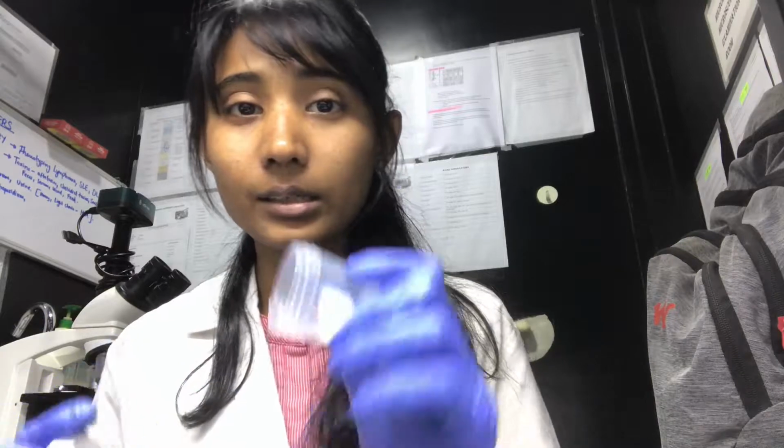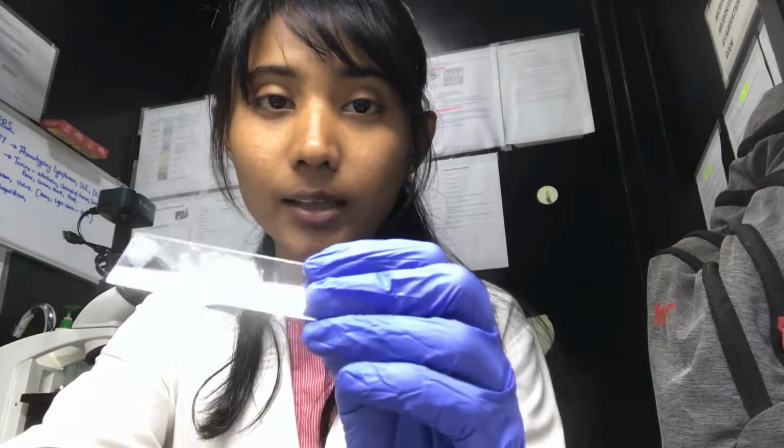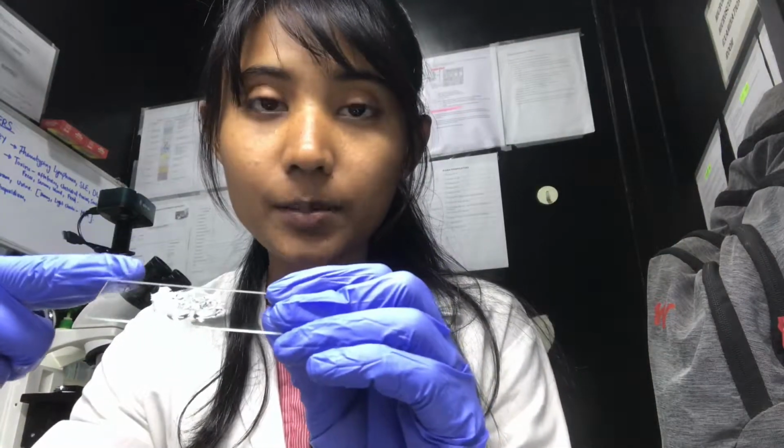So to evaluate your patient's hair, you need to pluck hair from different areas all over the body, wherever you see alopecia, and then collect it in an airtight container and submit it to the laboratory. Take a small pinch of hair and place it on the slide, add mineral oil, and examine it under the microscope. I have already done that. Now I am going to put the cover slip on to examine.